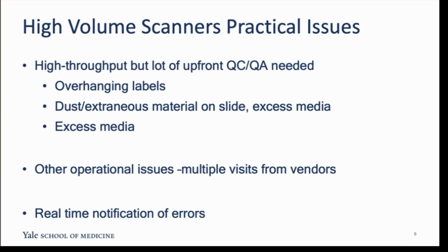So we wrote up a custom piece of software where now if there is a slide handling error in either of the scanners, it triggers an email message to our manager of scanning operations and some scanning techs, letting them know that the scanner has a slide handling error so that it can be fixed sooner rather than later. So we had to do a few rounds of this kind of troubleshooting before we got to a point where the scanners were operating in sort of a cruise control mode, which is ideally where you want to be in a clinical operation.